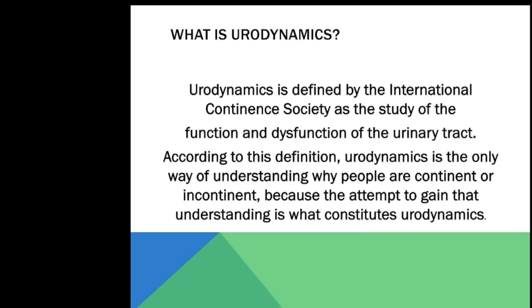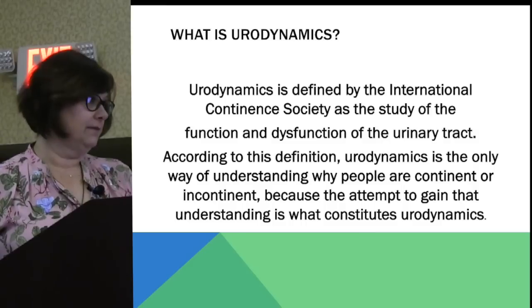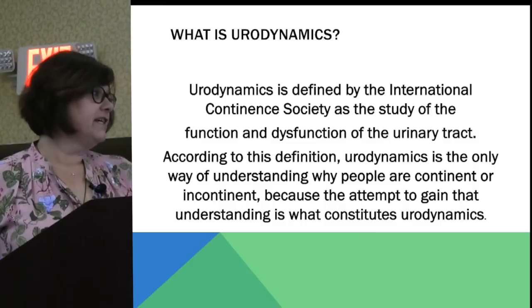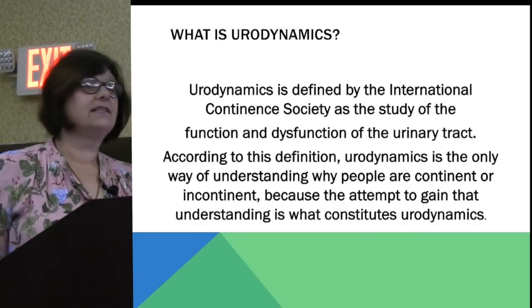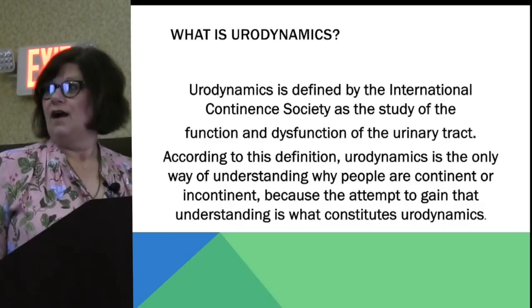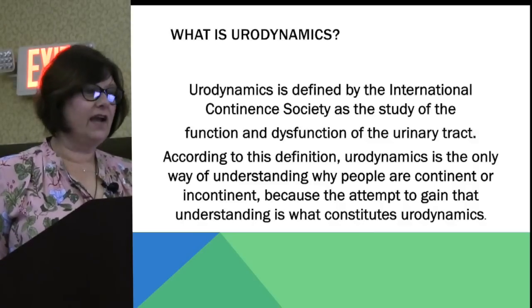So really, what is urodynamics? It's defined by the International Continence Society as a study of the function and dysfunction of the urinary tract. According to the definition, urodynamics is the only way of understanding why people are continent or incontinent, because the attempt to gain that understanding is what constitutes urodynamics. So you've got a patient who's having trouble with continence, incontinence, and you want to understand why these things are happening.